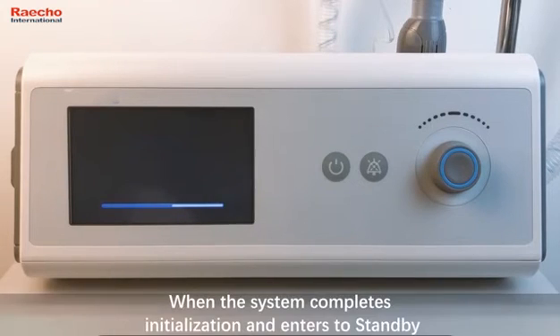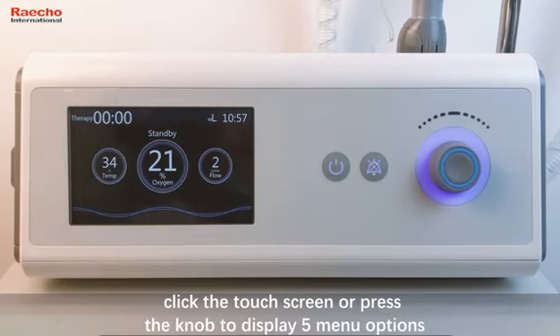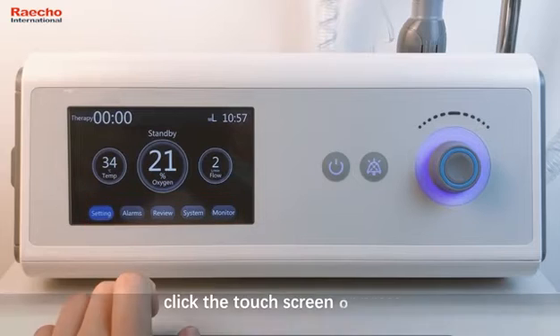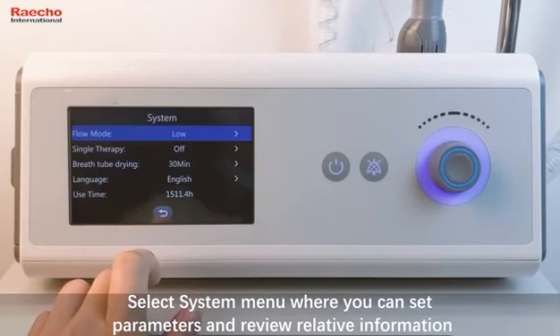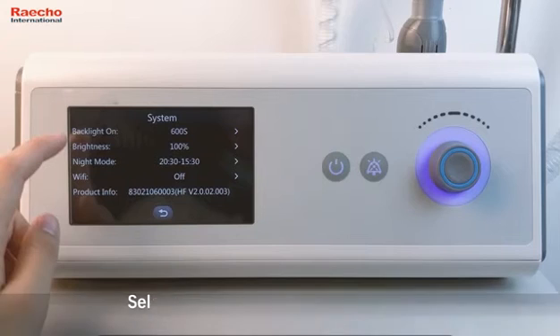When the system completes initialization and enters standby, click the touch screen or press the knob to display 5 menu options. Setting. Select the system menu where you can set parameters and review relative information.